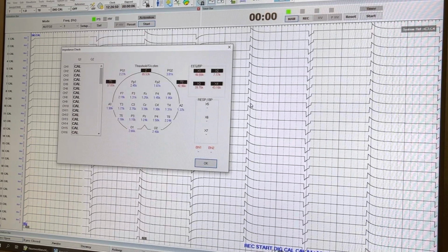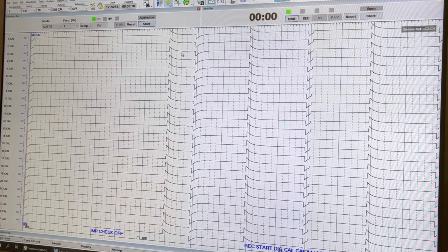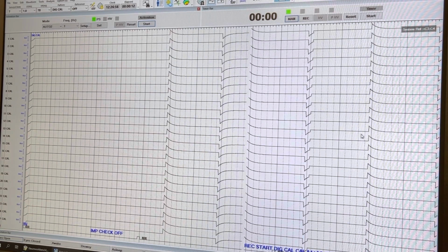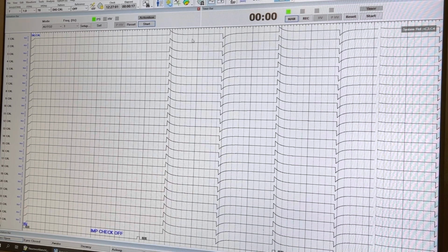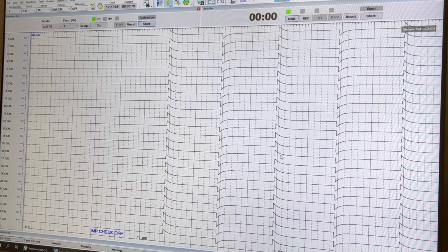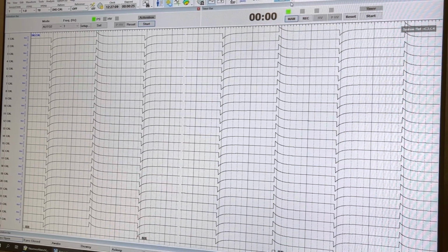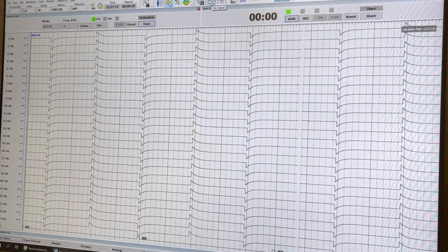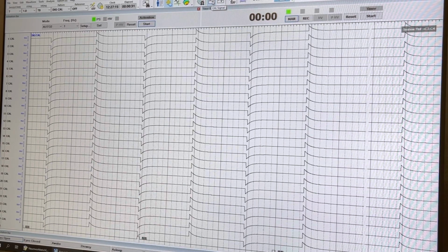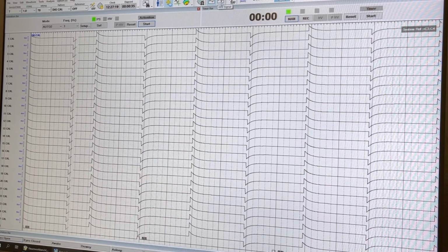And then it's pre-programmed to look at the impedances, but now you can see the background change to a duller background, because it's storing. You can see the green arrow going down. Then we're going to shut that off, and go right here for the EEG signal. So we're going to turn on the EEG signal.